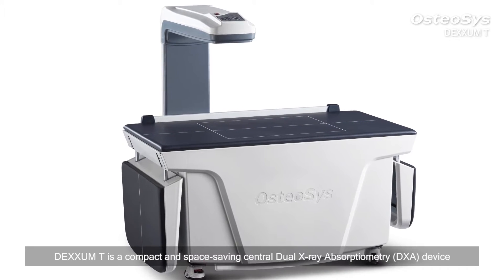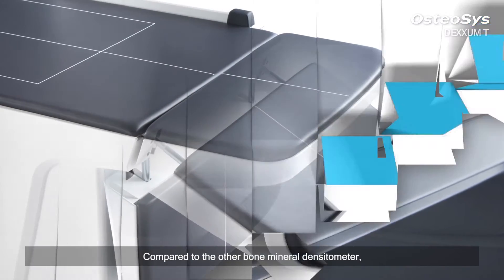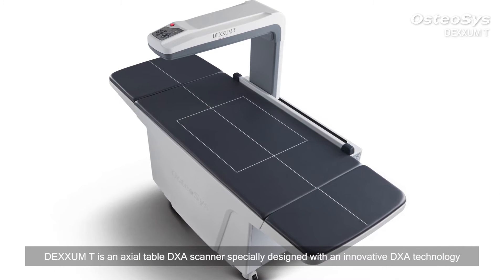DEXXUM T is a compact and space-saving central dual X-ray absorptiometry device. Compared to other bone mineral densitometers, DEXXUM T is an axial table DEXA scanner specially designed with an innovative DEXA technology.